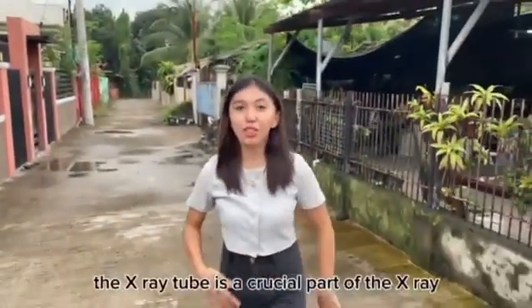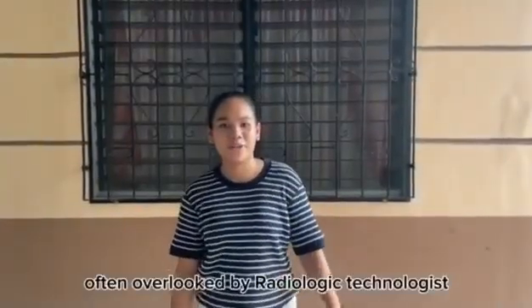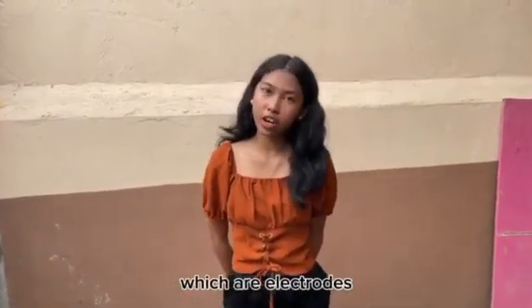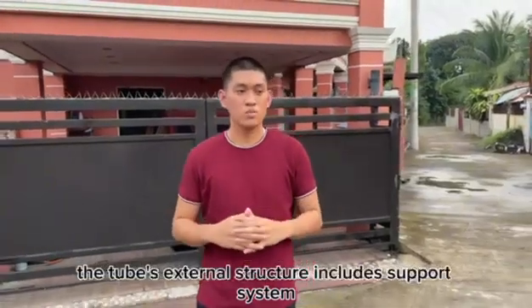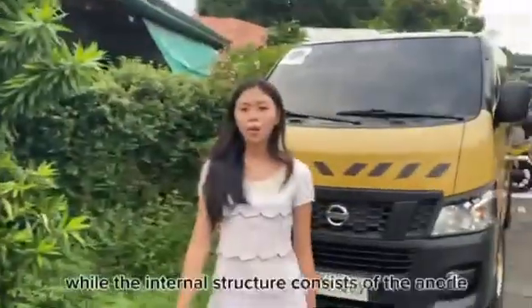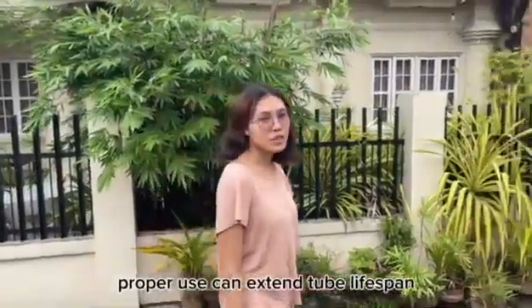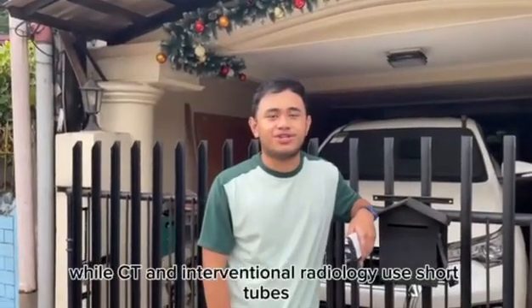The X-ray tube is a crucial part of the X-ray imaging system, often overlooked by radiologic technologists. It consists of two primary parts, the cathode and anode, which are electrodes. The tube's external structure includes the support system, protective housing, and enclosure, while the internal structure consists of the anode and the cathode. Proper use can extend tube lifespan.